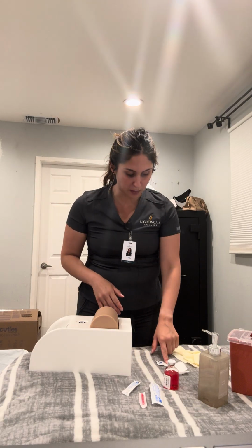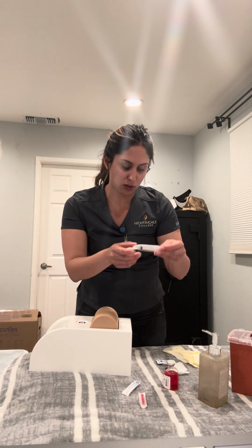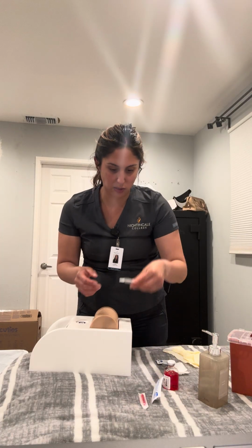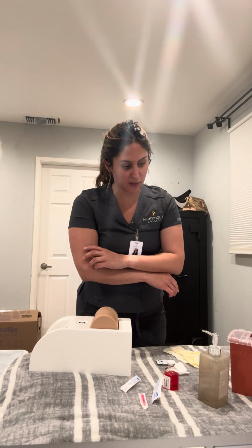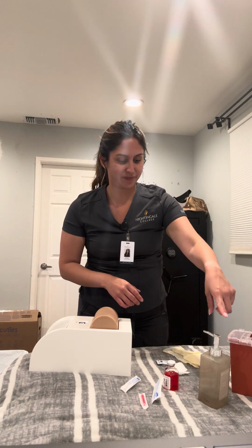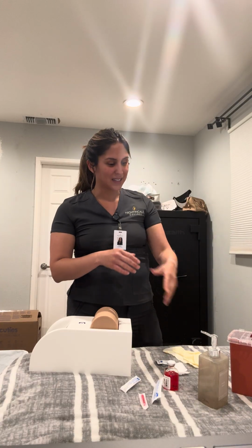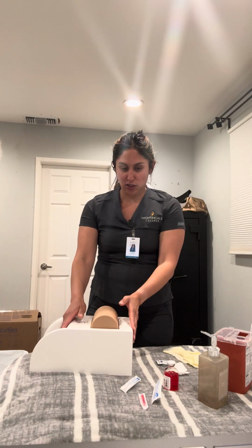First, we're going to gather supplies. I have my gloves, alcohol pads, gauze, my medication, a 3 ml syringe, a 22 to 25 gauge needle, which has to be 1 to 1.5 inch, my hand sanitizer, a sharps container, and I have my patient.